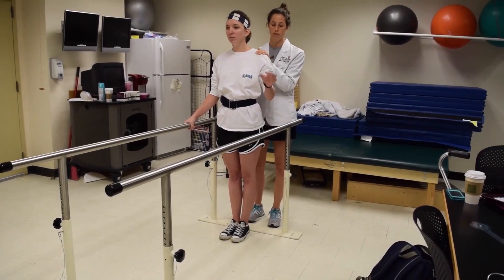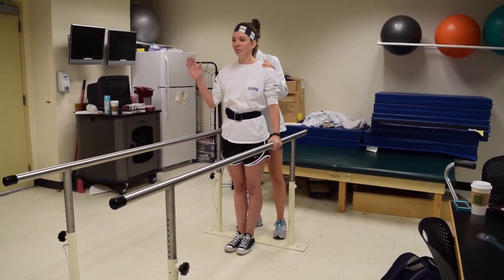Good. Still feel okay? The next thing we're going to do before we start walking is — simultaneously if you can — you are going to lift your right hand off of the bar and your left leg off of the ground.